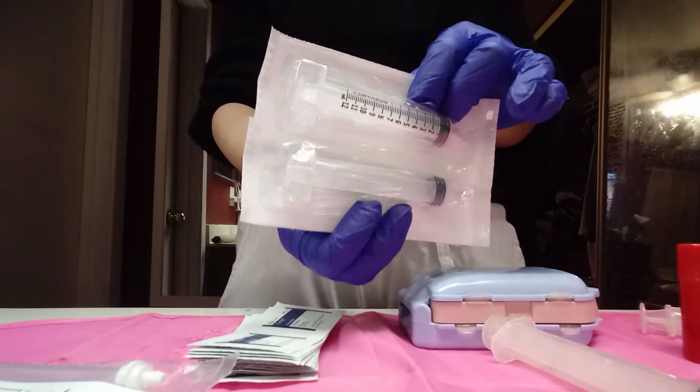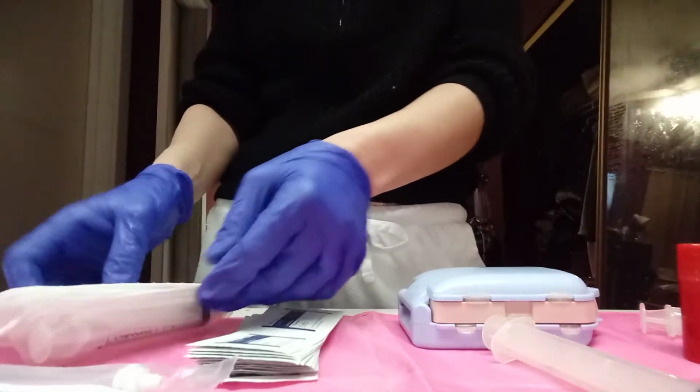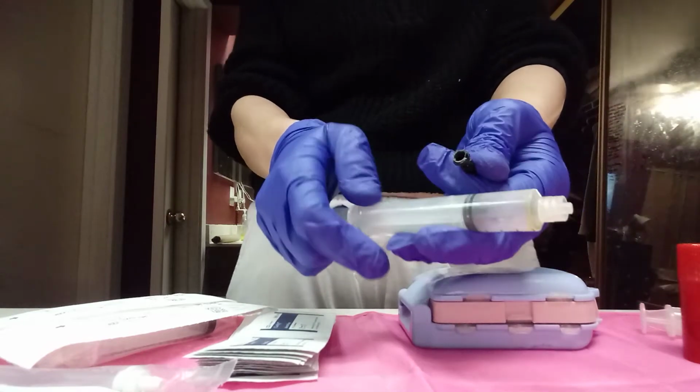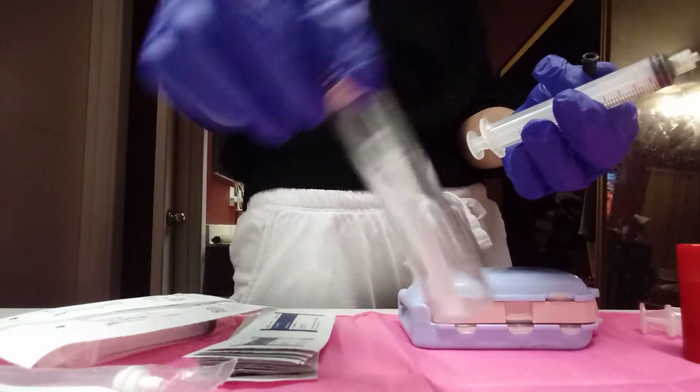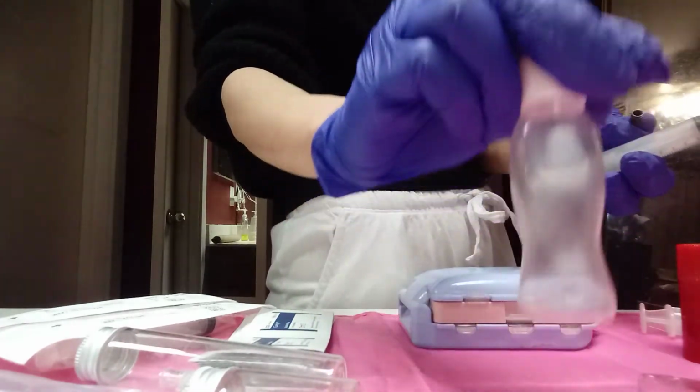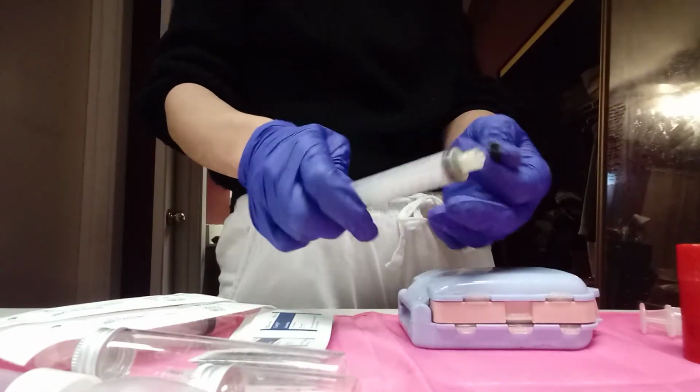because it's a lot easier to fit. They're a lot easier to pre-crush, and on Amazon they're called blunt tip syringes. I have several here, little cases, and I keep my different size blunt needles in here so that I can access my medication and draw it out. So you have this size all the way down to this size and even smaller. That's all on Amazon. Another thing you can do is buy these little containers at the dollar store, and you can pre-fill these and bring those with you. So there's one idea. The other idea is to buy these blunt tip syringes.